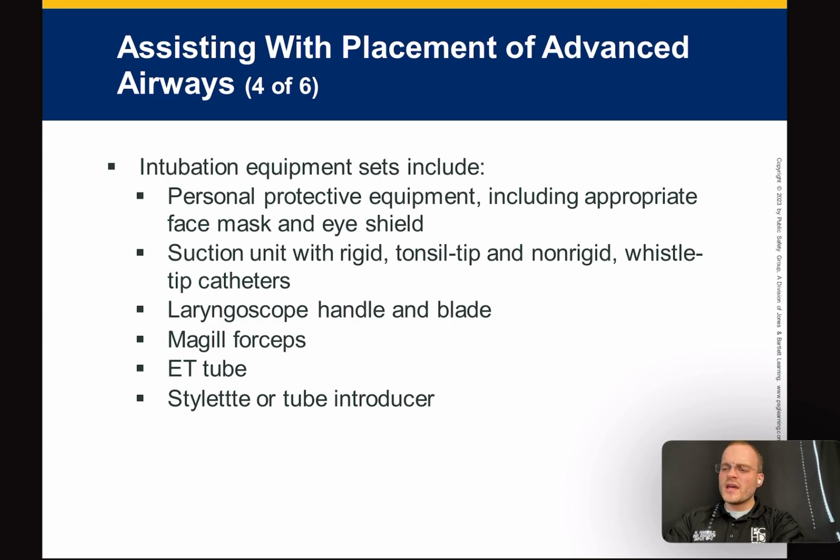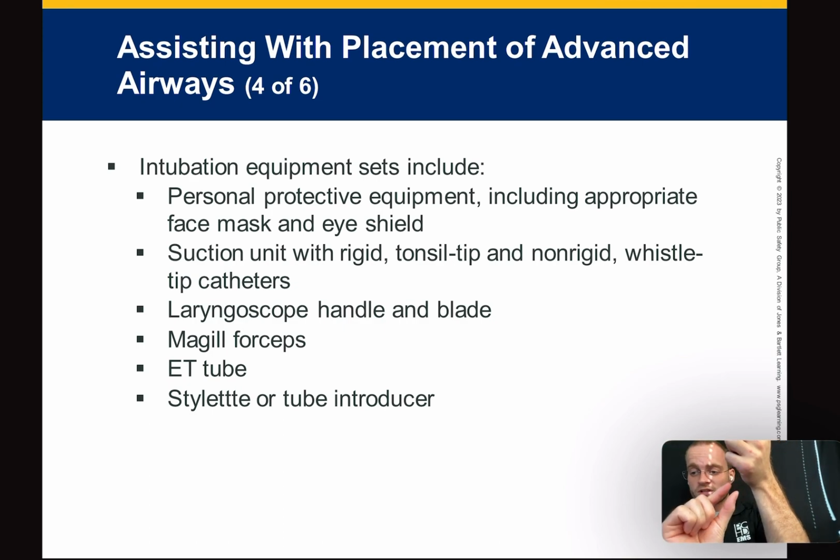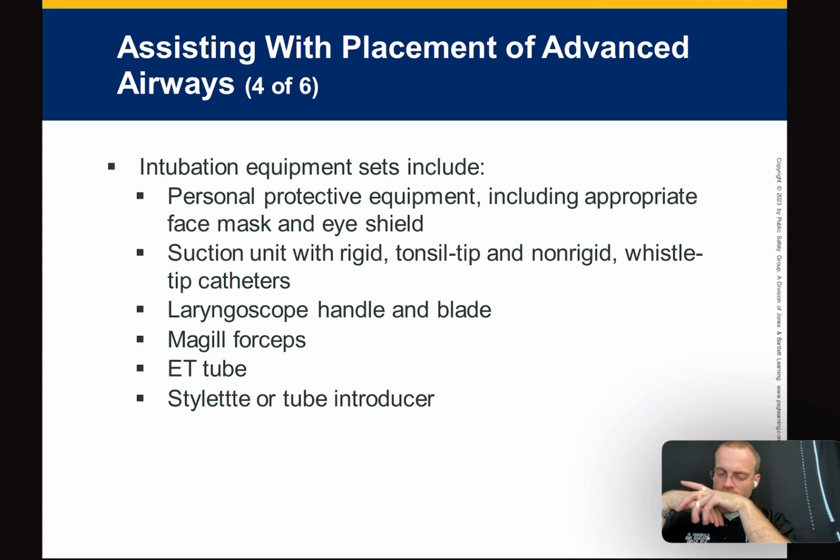There's a lot to it, and what's hard about it is you stick, again, we'll show you in class, this tool in someone's mouth, and you have to lift up their jaw and tongue, and then look in their mouth, right? And then you have to take the tube and position it perfectly in their little bitty trachea through their vocal cords into their trachea, right? So it's all these steps, and it's not hard per se, it's just commonly messed up. One of the reasons is because we don't do it terribly often. Maybe a couple times a month on most systems, most services, but as a paramedic. But anyways, we'll talk about this in class.